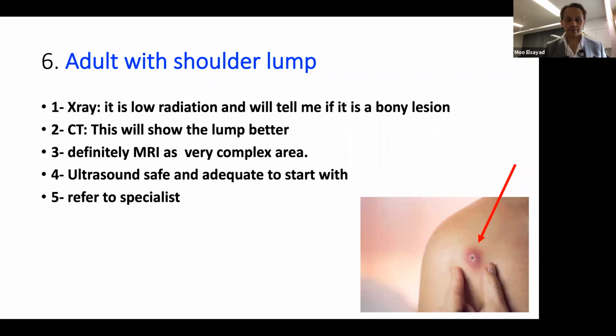Any age? Could be any age from 18 or 20 till 90, 100. Let's check some responses. We've got number 3 now. Perfect. So we've got 3 and 4. Okay, good. Perfect. I like this.